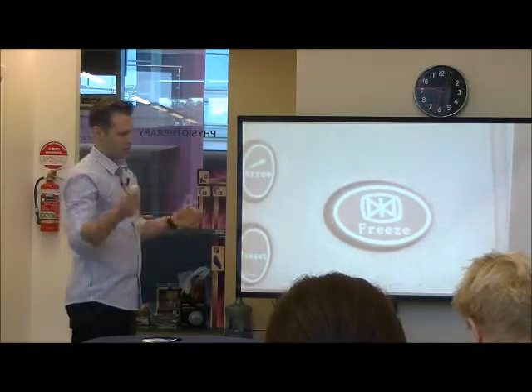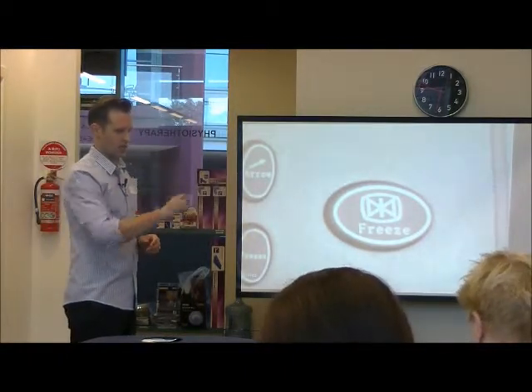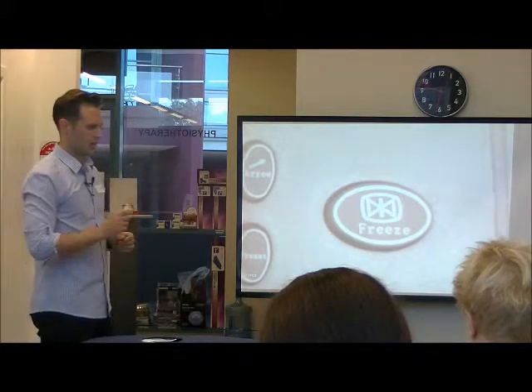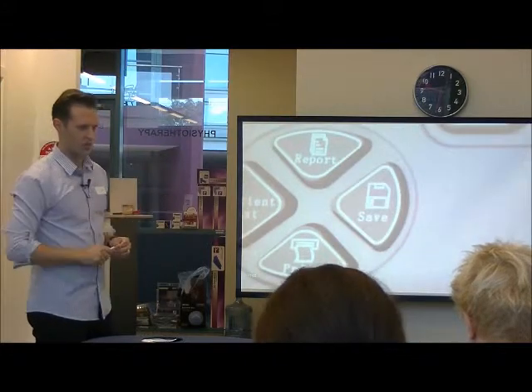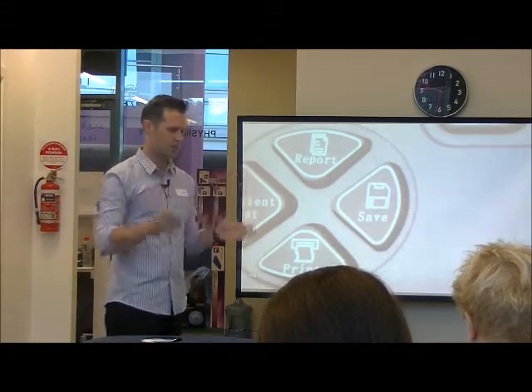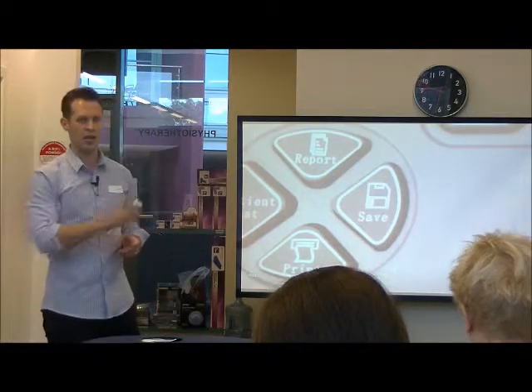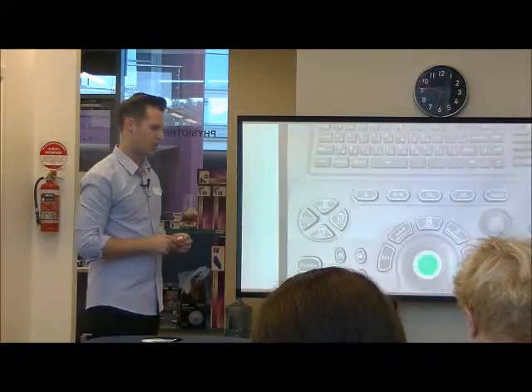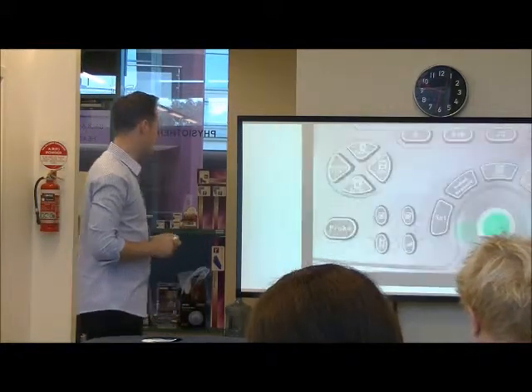The freeze button is really useful for when you get an image that you want. You hit the freeze button and you can zoom back in and out of the particular frame that you'd like to get. And of course, save is very self-explanatory. So we do want to be saving images. We want to have something that's concrete, something that's objective, something we can go back to our patients with and say, hey, this is where you were on this day and this is where you are today. Because patients absolutely love those numbers, don't they?